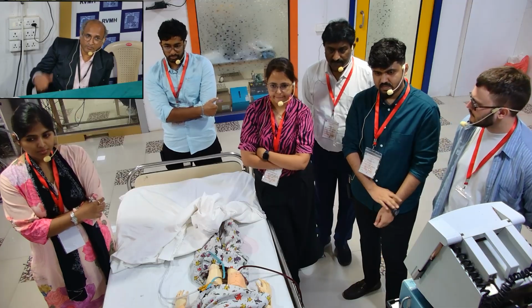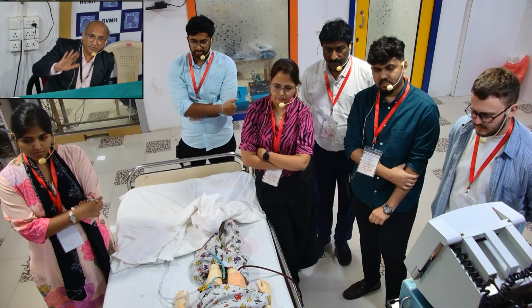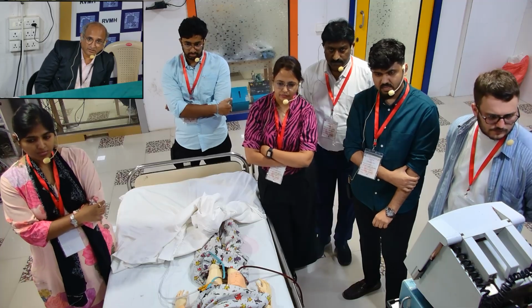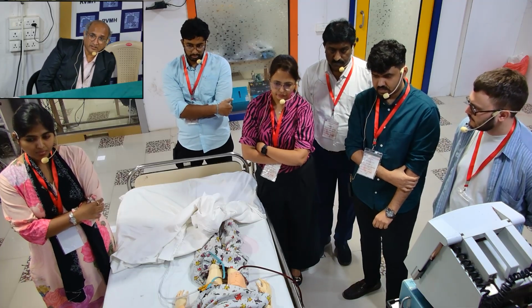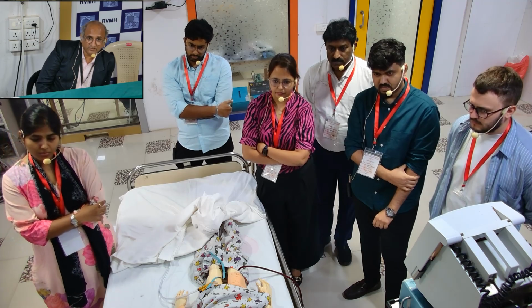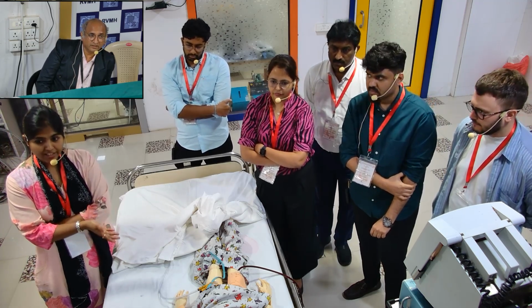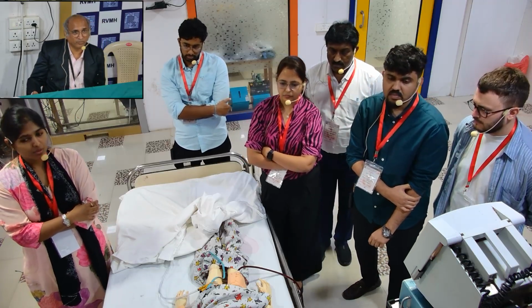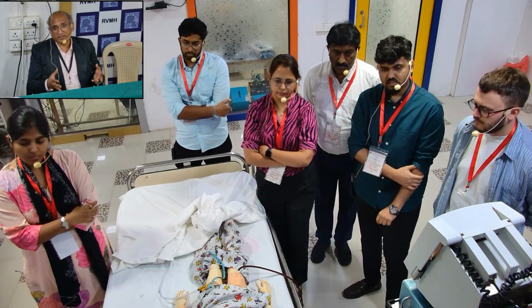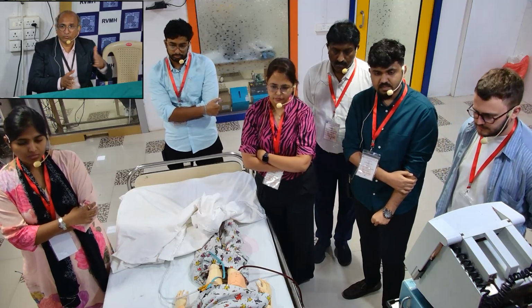Okay. So always remember that with sudden things, you have to think there is mostly something like an issue with the circuit. Another thing that can give rise to something like this is a tamponade effect. But it was 2 days later. Yes, so that is less likely. But what are the other differential diagnoses I am talking about? It can be a tamponade effect. But again, a tamponade effect probably is not going to be that sudden. It's going to be gradual. Gradually, your flow will come down.